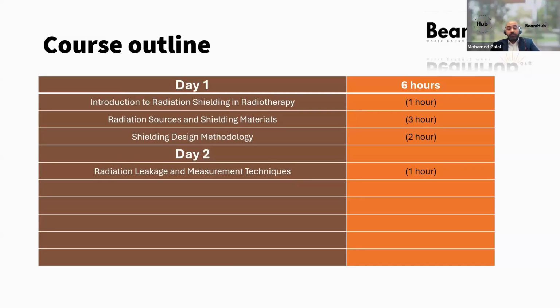and what you need to do, which dosimeter or which survey meter you can use, sorry, and what you need to do maybe after the survey. You can just stick a couple of dosimeters for a temporary time, like a week, month, or 3 months. So what is the best thing to do for this one, and how to generate a report overall.